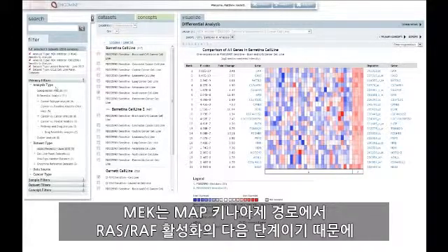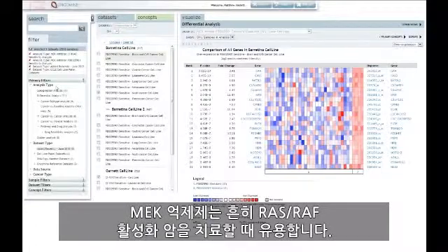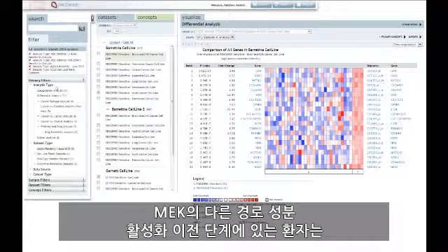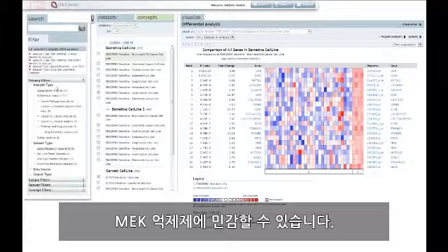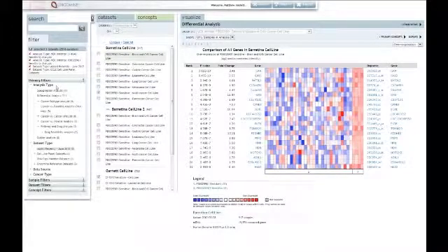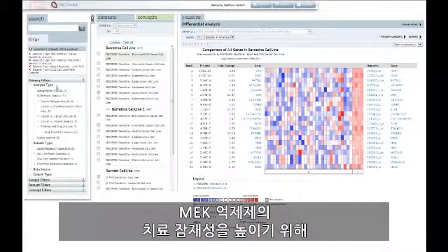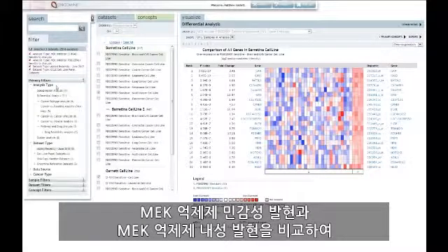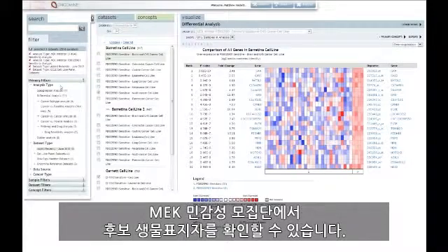MEK inhibitors are often useful when treating RAS-RAF activated cancers because MEK is downstream of RAS-RAF activation in the MAP kinase pathway. Thus, patients with RAS-RAF mutations and other pathway member activation upstream of MEK may be sensitive to MEK inhibitors. In order to broaden the therapeutic potential of a MEK inhibitor, we can identify candidate biomarkers for MEK-sensitive populations by comparing MEK inhibitor sensitive versus resistant expression across all cancer cell lines for these multiple MEK inhibitors.